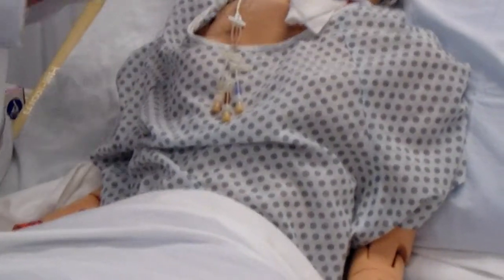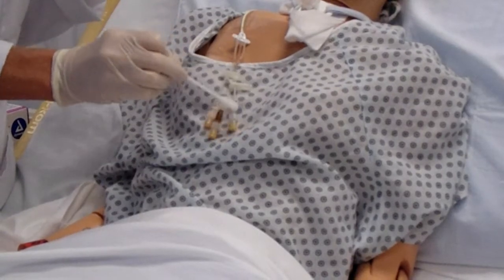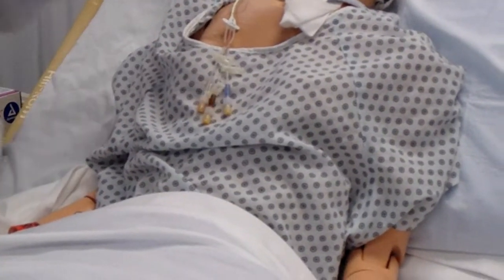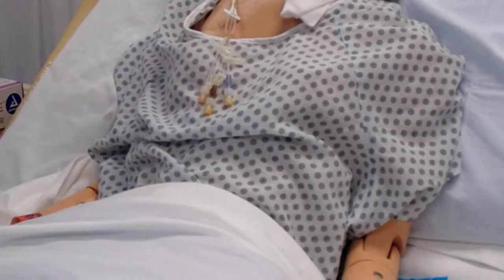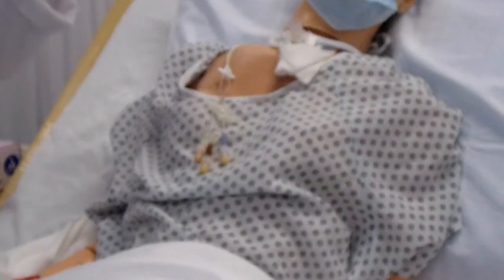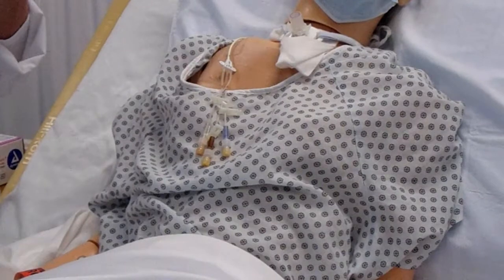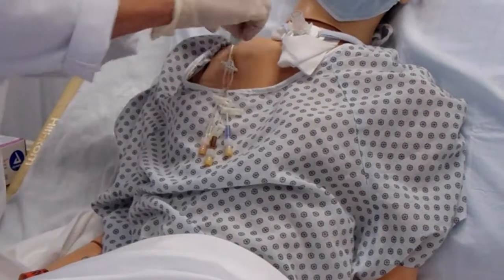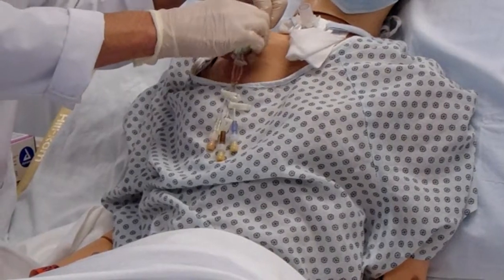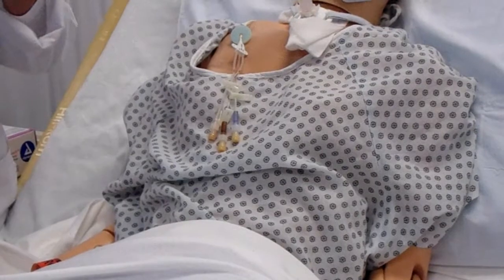And number 3, a wider circle, and down the tubing to include the ends. I am now allowing the area to air dry. The area is dry. I'm applying the bio patch with the blue side up. How you doing, Miss Cooper? Patient reports she's doing fine.